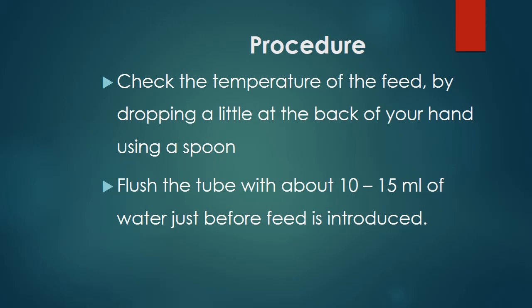We use the back of the palm because that has a skin texture similar to that of our mucous membrane. Under no circumstance should you use the palm, because the palm is very rough, hardened, with fewer nerve endings. So the food may be at a higher temperature that you will not know because you have used your palm. What the palm can resist will not be compared to that of the mucous membrane. So it is always advisable to drop a little of the food that you are coming to feed at the back of your palm to determine the temperature of the food before commencement of feeding.